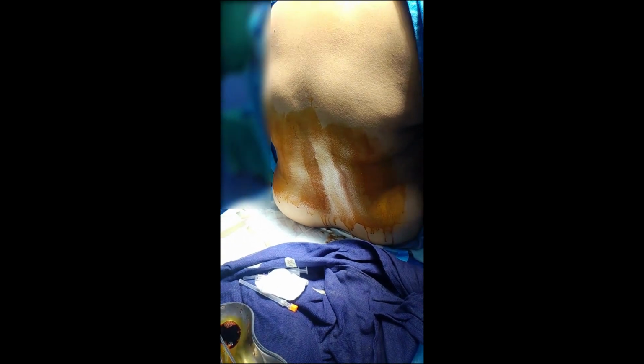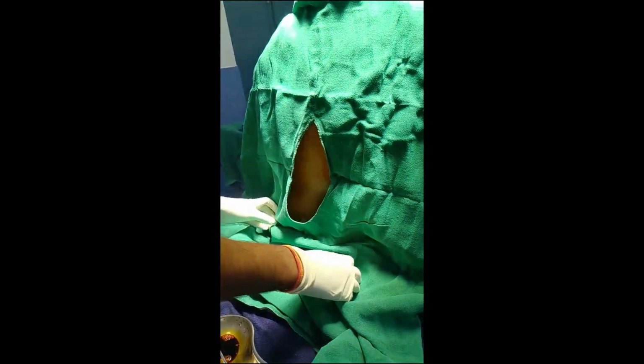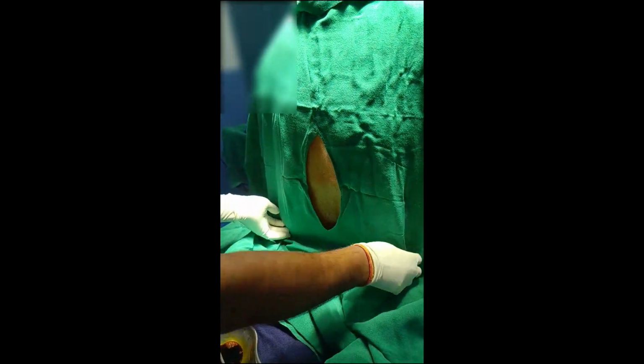Let the betadine dry for a while. You can leave it for 1 minute. Now put on the eye towel. Now ask someone to put spirit over there.